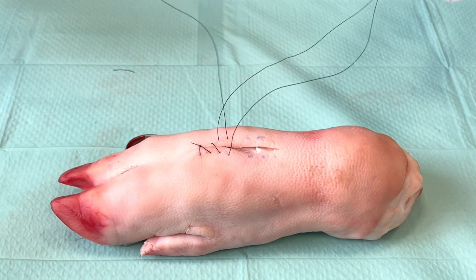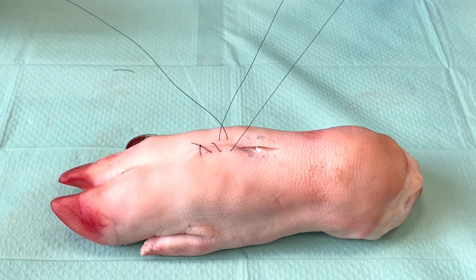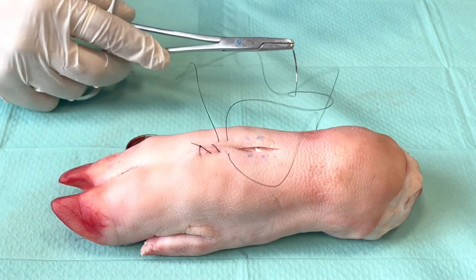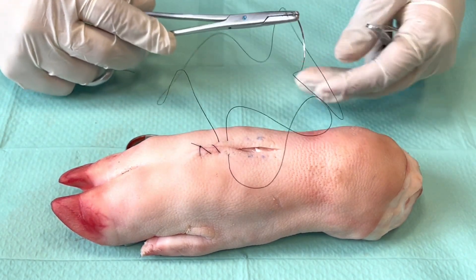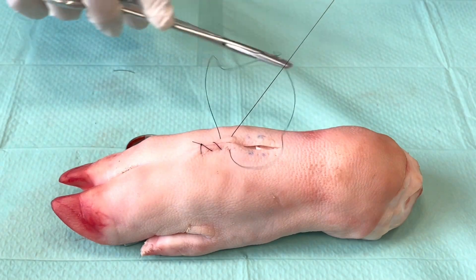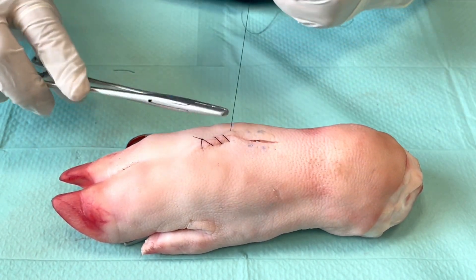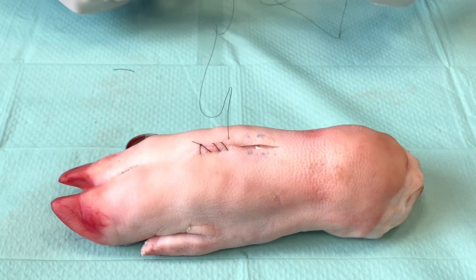I'd like to show you a difference between a simple continuous and a running locking suture. You saw how it got tangled up a little bit — you need to remember to come out on the right side of the suture loop so that you don't make a running locking stitch.